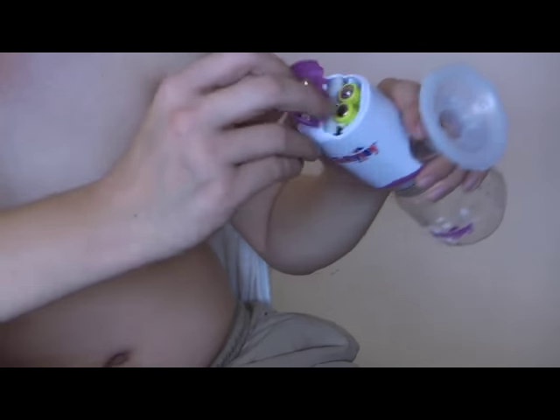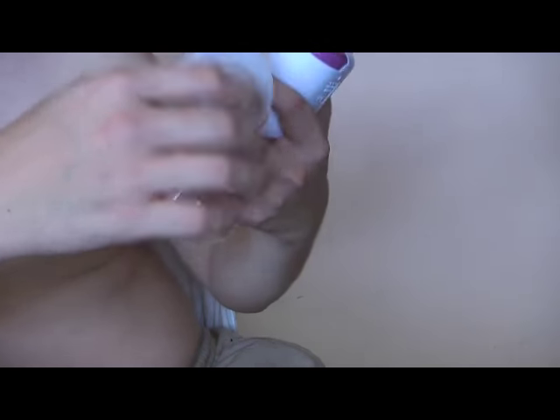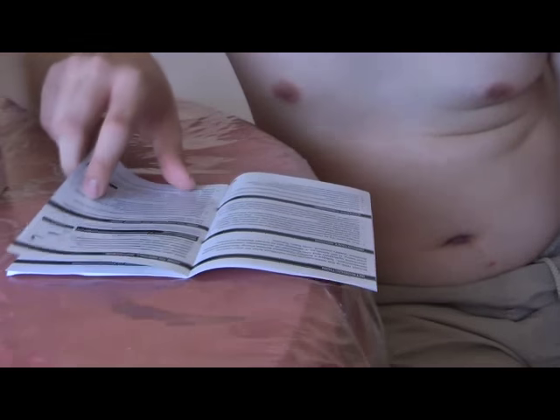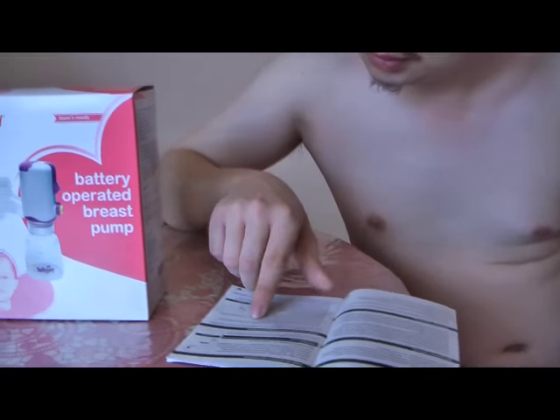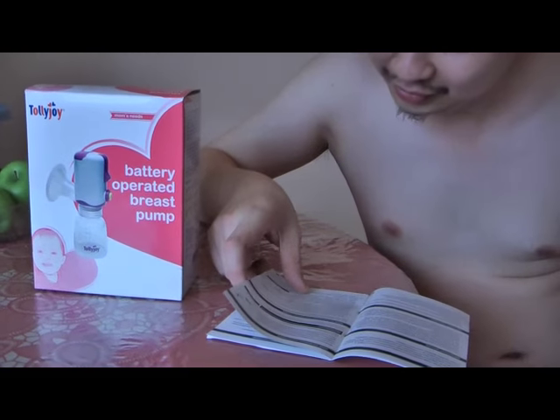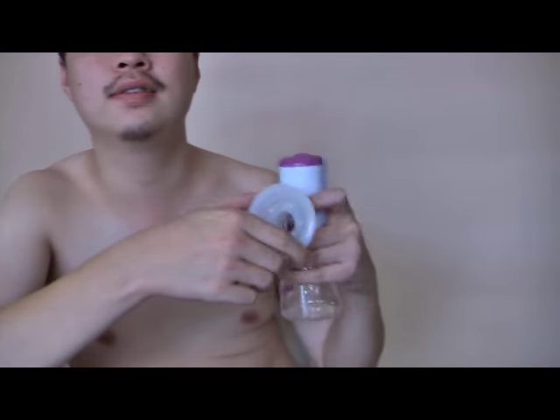It's powered by a motor and you can put AA batteries, normal batteries. Apart from that you have the gasket, funnel — we call this the funnel unit. This is the funnel unit.